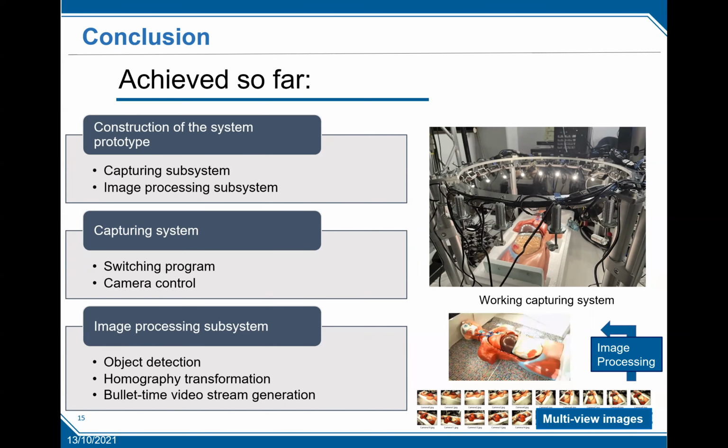At present, the gaze point is set precisely on the basis of the coordinates of the detected object given by the YOLO detector. In the future, we will build on the existing research to improve the latency and the accuracy of the gaze point setting, and on the other hand, import real surgical scene data to try to identify and solve the problems caused by the differences between the real data and the ideal data.